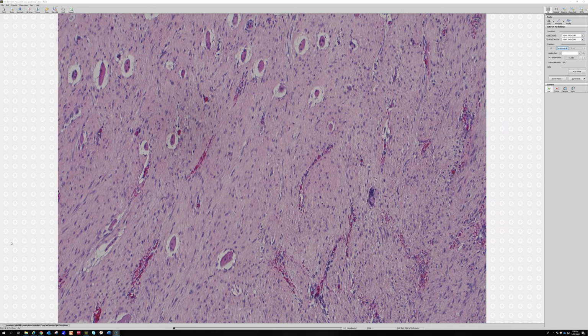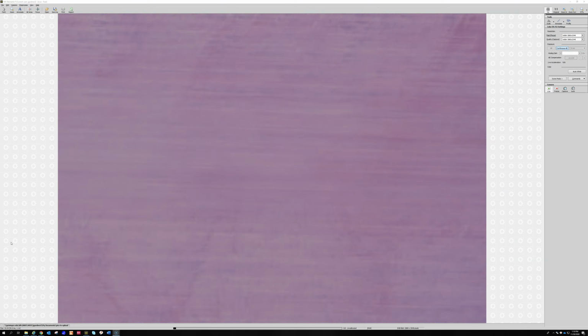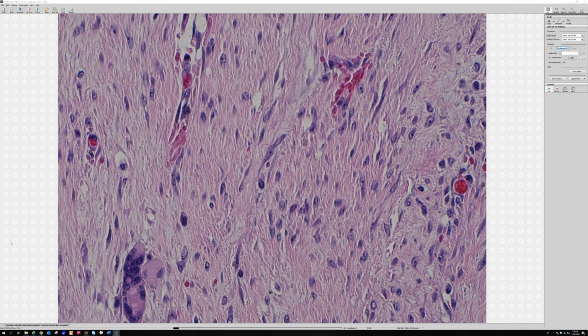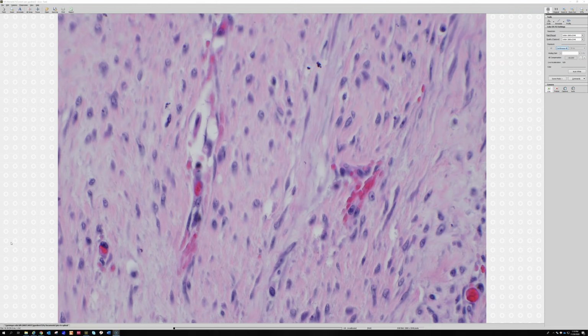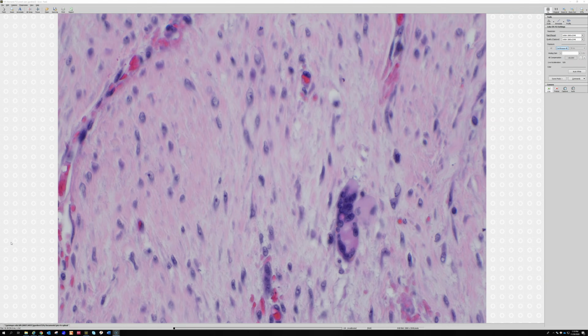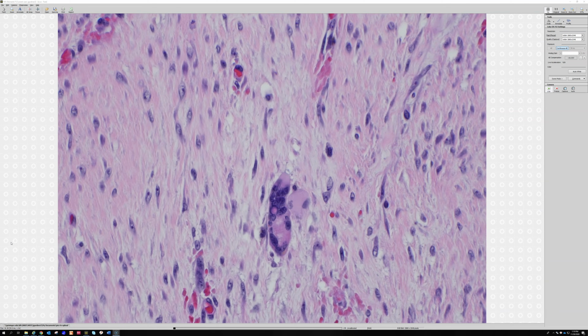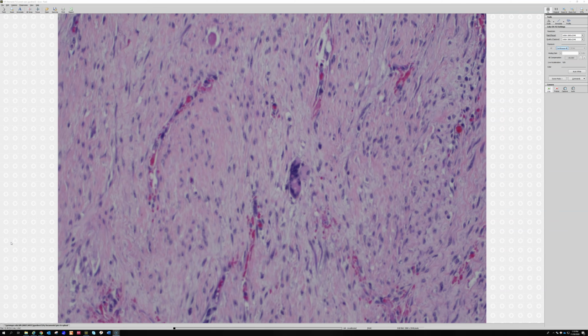Also, when they get caught up in the middle here, sometimes they get really tiny and their nuclei begin to overlap. Like atrophy. Exactly. That's muscle atrophy, and good job picking that up. That is such an important thing to recognize in all parts of soft tissue, because sometimes muscle atrophy can look really weird and bizarre and can mimic pleomorphism. You can imagine if these nuclei overlap a little bit more, that could make you think of a pleomorphic cell, and then you might start thinking this is a sarcoma or something like that.